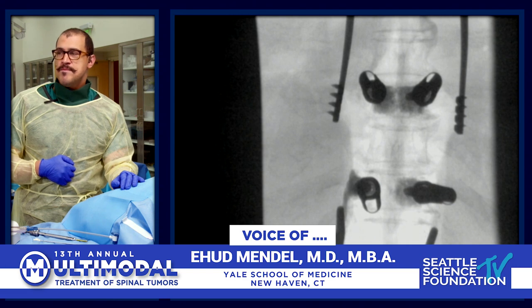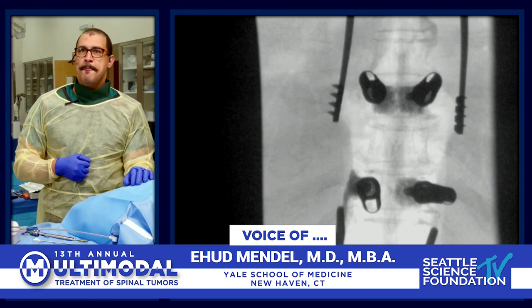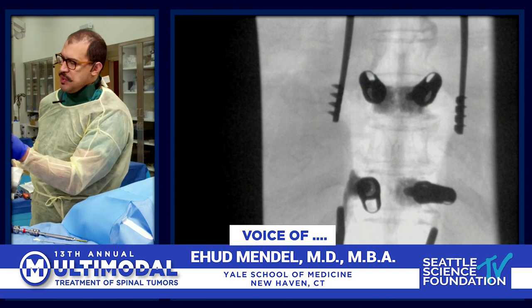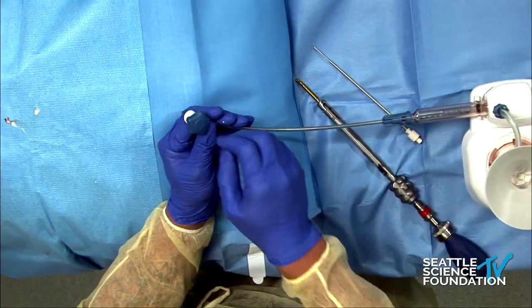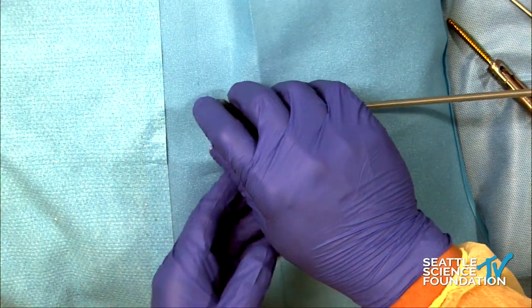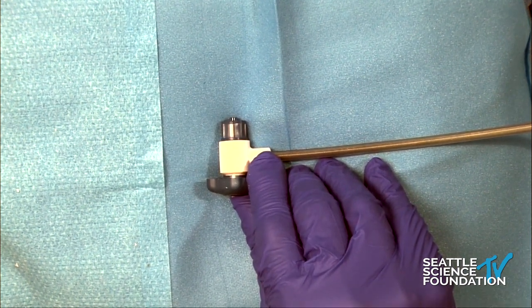A couple of quick questions. This particular setup — I noticed that you keep your hand on the blue twisty thing, and I think that is important because sometimes what happens is as you inject the cement, the cement pool pushes the needle backward. So you've got to make sure. There is a locking mechanism, though I don't 100% trust that, so that's why I'm keeping my hand there just to make sure it's staying in place. This one does have a locking mechanism that allows it to hold onto the top of the screw and keep it in position.